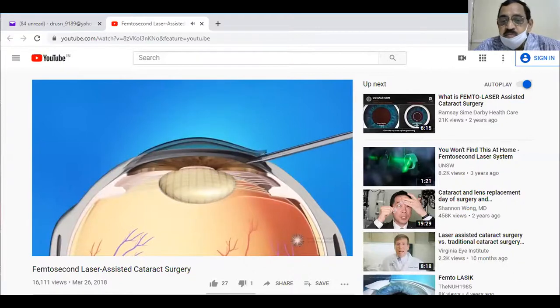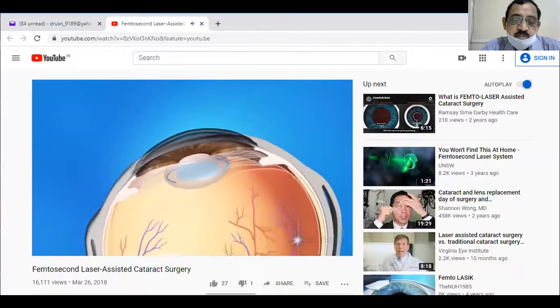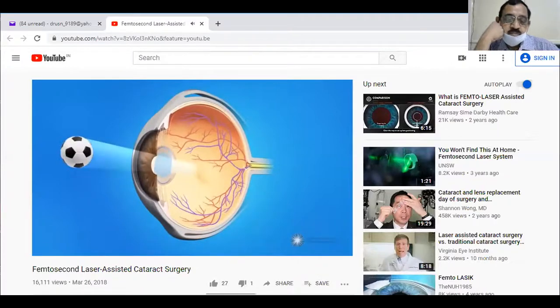Then your eye surgeon will insert a pen-shaped instrument through the opening to reach the lens. This instrument uses a special type of energy to break up the center of the cloudy lens. Then it will carefully suction out the lens pieces. Your surgeon will then insert an artificial lens, called an intraocular lens, or IOL. This IOL will stay in your eye permanently. The new lens lets light pass through and focus properly on the retina, bringing back clear vision.